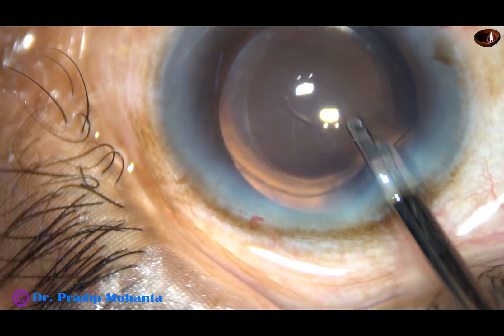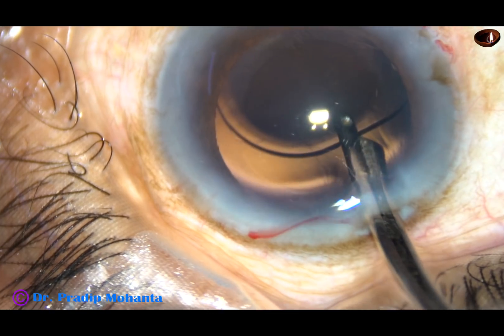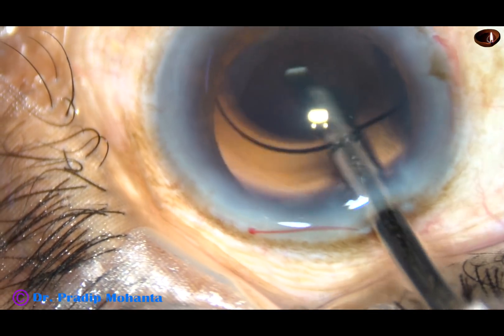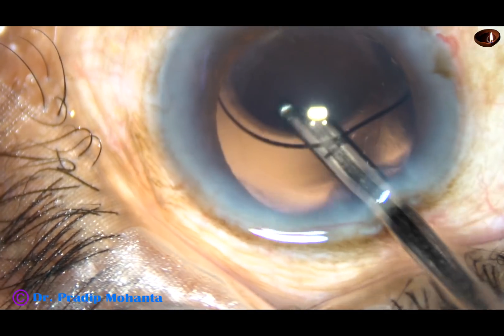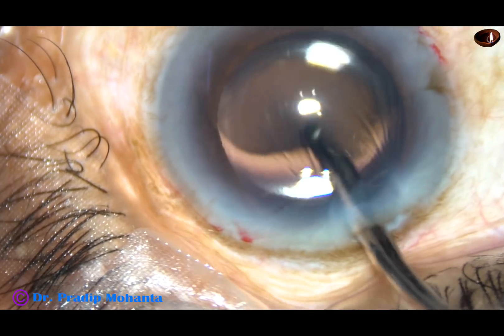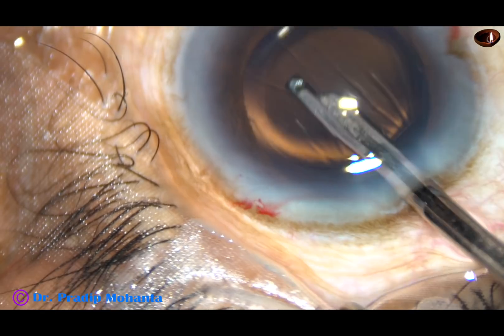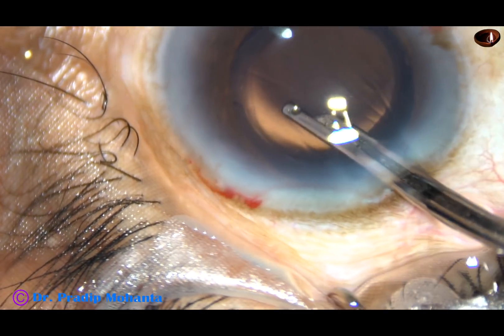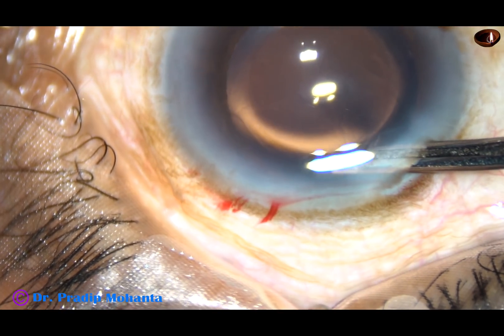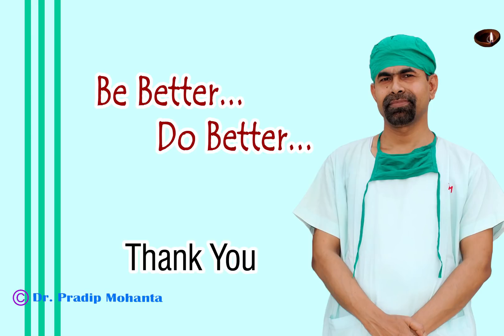And now this is the final lavage of the anterior chamber. I am going behind the lens. There was something sticking to the posterior surface of the optic of the lens, which has been removed. Now the anterior chamber is formed and the case is concluded. Thank you very much for watching. Hope this video will help you in developing your surgical skills.